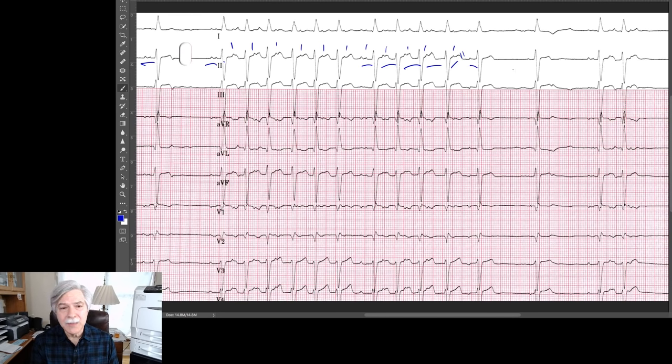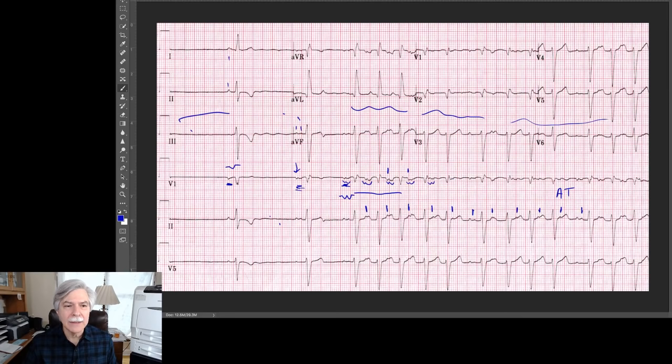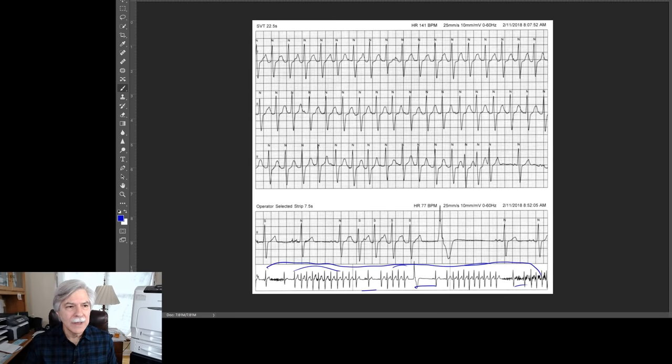So this is actually maybe a sinus beat here, and then this sinus beat, clearly the P wave looks different, but look, now it's back, this bifid P wave is back again. So it almost looks like you have the sinus node in one spot and this ectopic focus in another spot that's firing, and it's firing again and again and again. So this was happening constantly. When you look at one of these other strips down here at the bottom, this is incessant all day long, and she's having this rapid beat.